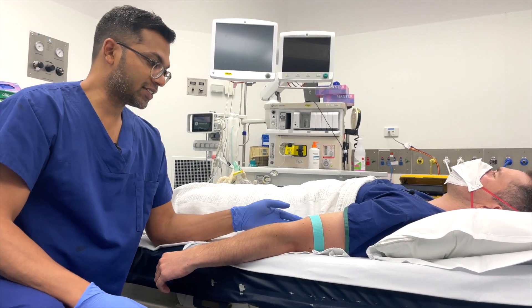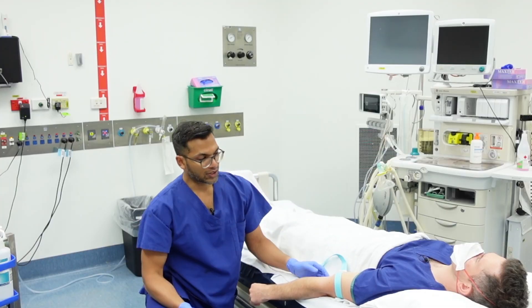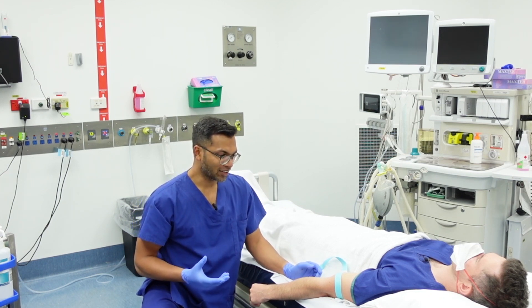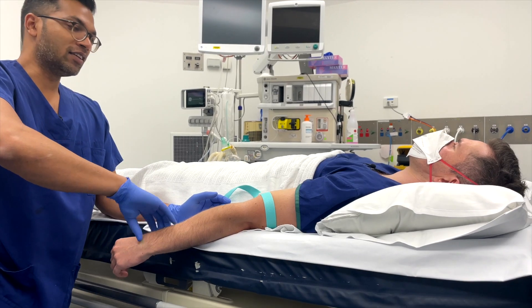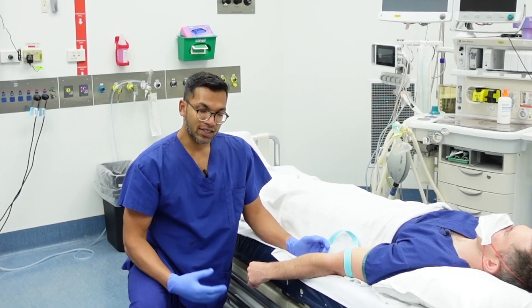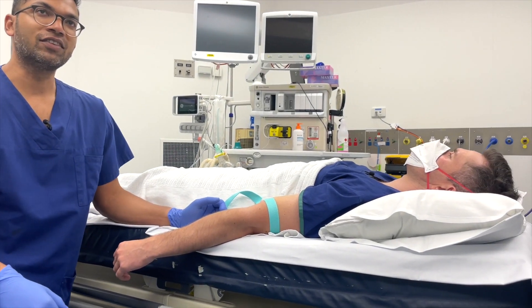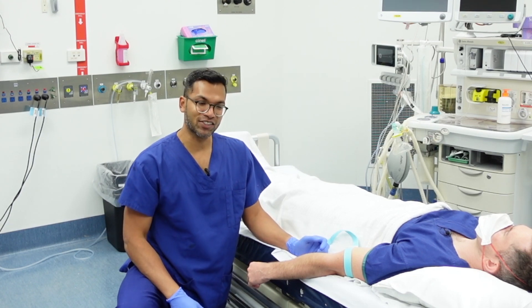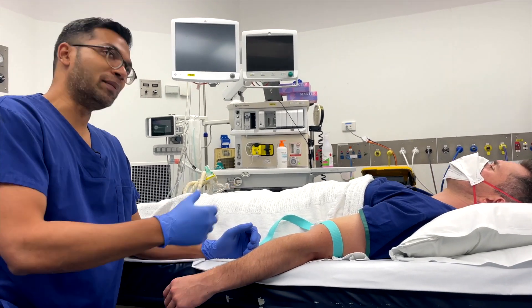The tightness of the tourniquet is really just a gentle pull. You know it's too tight because the patient will be complaining, or you may not feel an arterial pulse. Remember, this is a venous tourniquet — you just need it above venous pressure, not above arterial pressure. If you really want the perfect amount of pressure, you can use a blood pressure cuff inflated to just below arterial diastolic pressure, that way you get maximum arterial inflow and limit venous backflow.